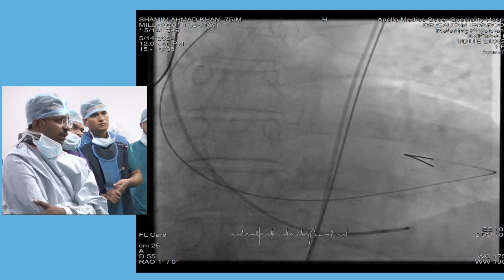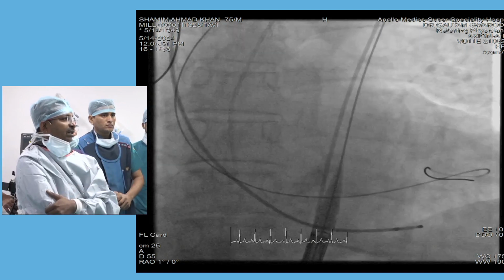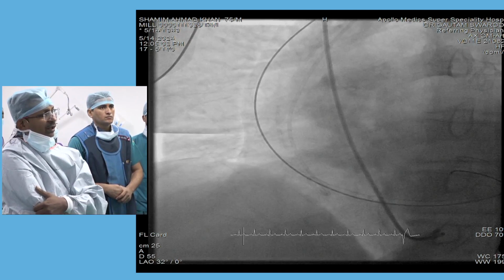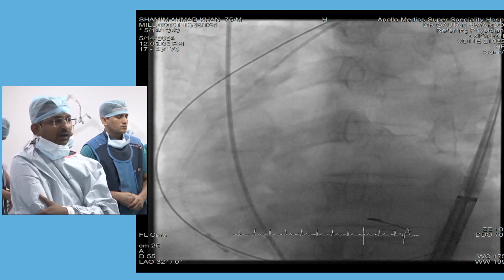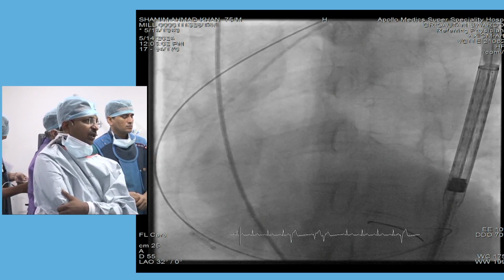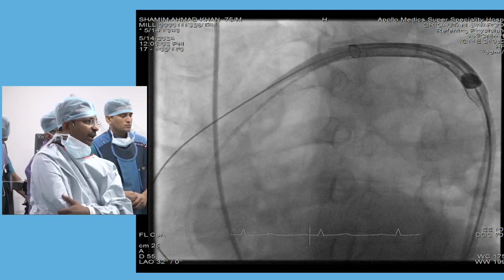Now it was time to exchange our delivery catheter with the 18F sheath. This is our delivery catheter, and this is the trackability. The Evolute FX is a very beautiful device in terms of tracking, and we didn't have any problem with the valve tracking and the valve crossing. So the idea of taking the snare was actually dropped, because we didn't feel any problem in the valve tracking and the valve crossing.